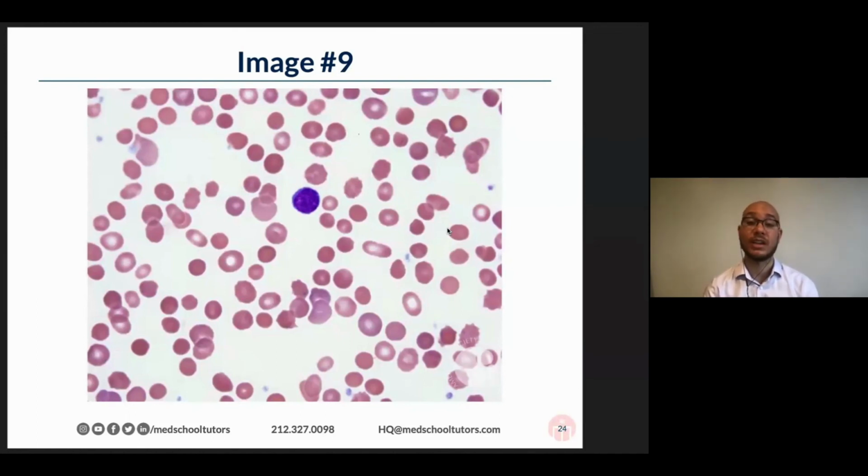Hereditary spherocytosis is one cause that can be tested on examinations. And I'll just point out here, this cell sort of looks like an elliptocyte, and there is a disease called hereditary elliptocytosis. I'll tell you that's not the diagnosis in this case, but there is a genetic disorder of red blood cells where the cells take on this elliptical shape. So that's absolutely something that you might call out.